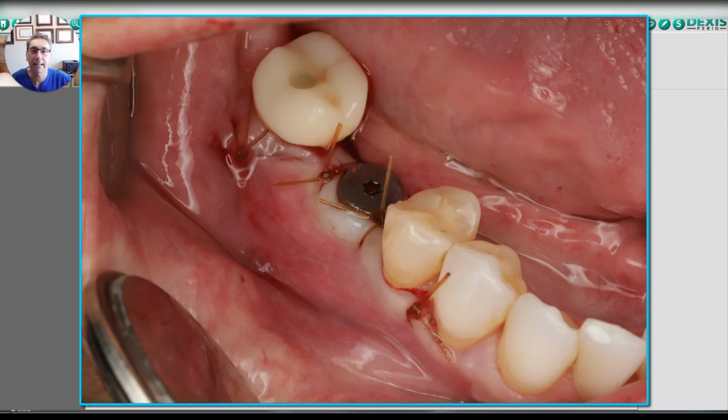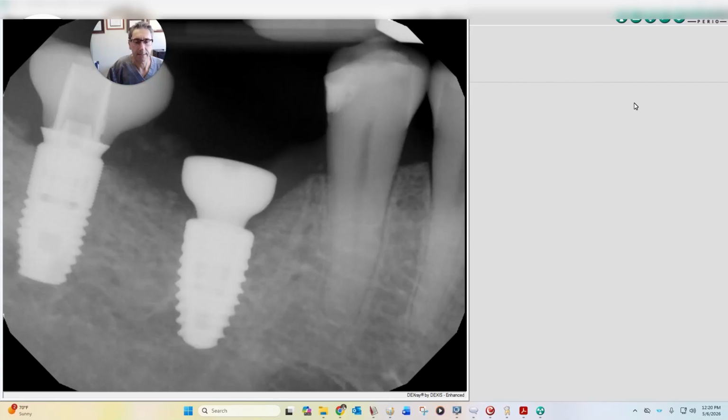As you know, in most cases of peri-implantitis with severe bony defects, it takes months and months for bone regeneration to fix those. But in this case, with the technique that we used, we did everything in one stage. In less than 4 months, we can finish the case and send it to the general dentist. And this is the final x-ray. A wide healing abutment, 6.5 by 4 millimeters, was placed here.